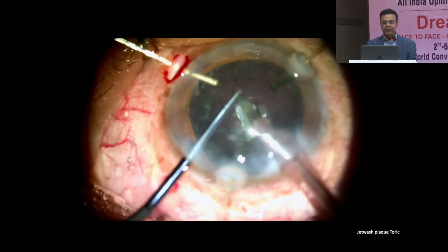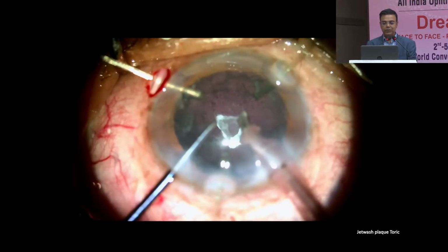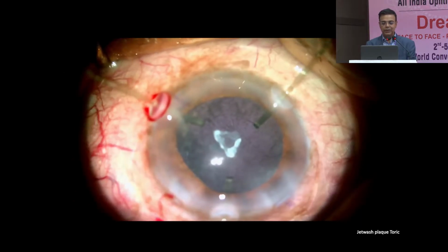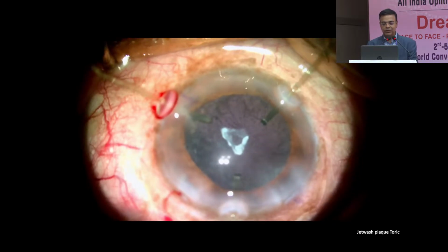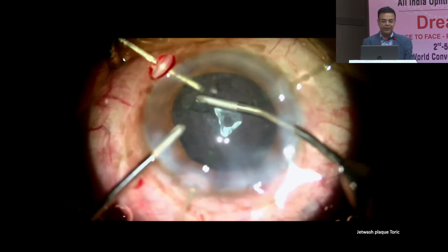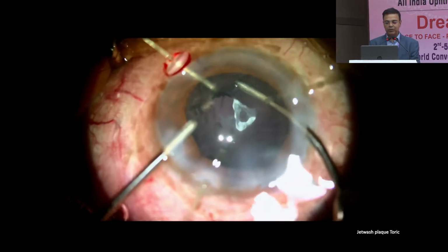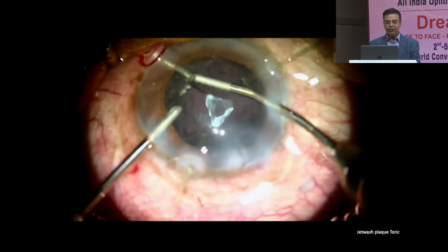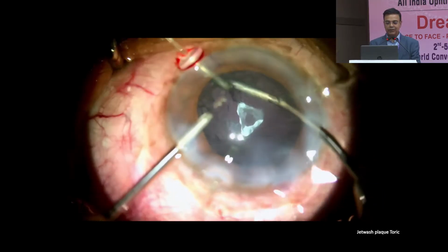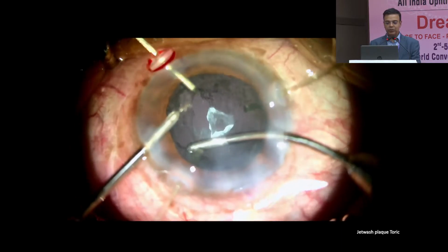But at the end of the cataract removal, we realized that the capsule was totally stuck with plaques. There was this big central plaque, and then cortex which was very densely adherent, and of course it was a very friable capsule, highly amenable to zonular dehiscence. As we tried to peel off all the stuff which was stuck to it, in almost 5 minutes we managed to remove only a very small part.